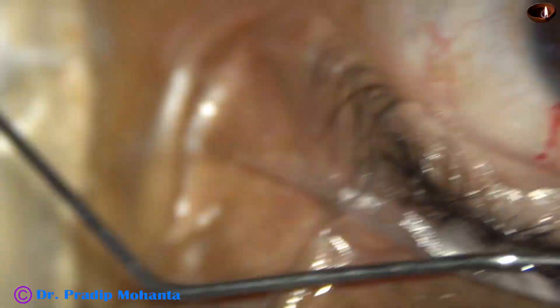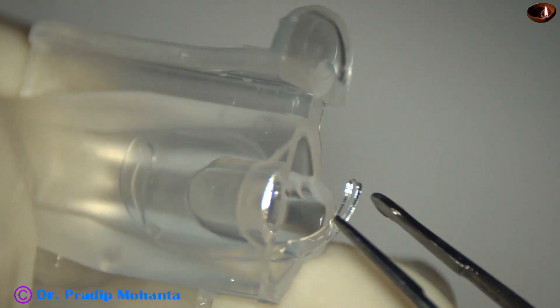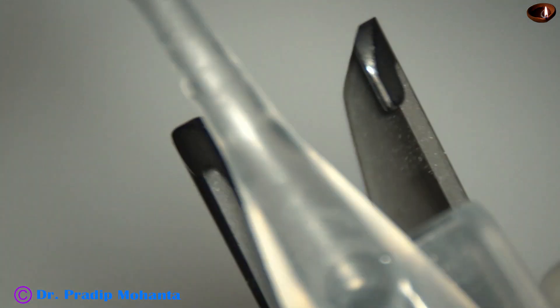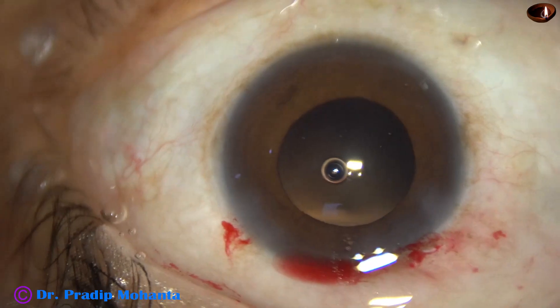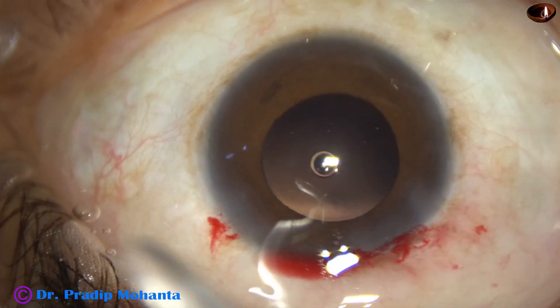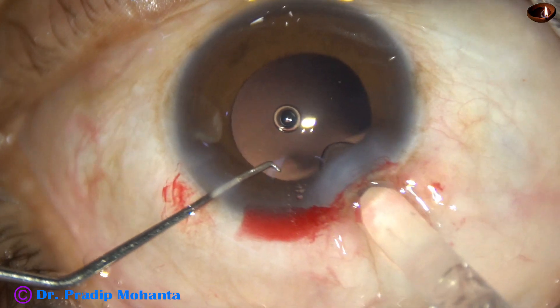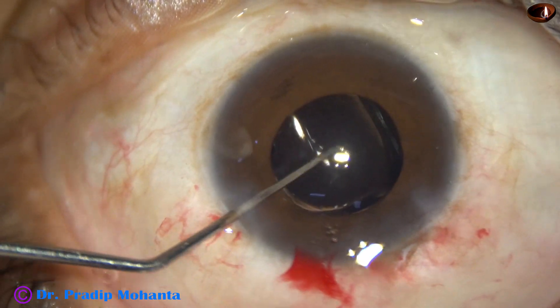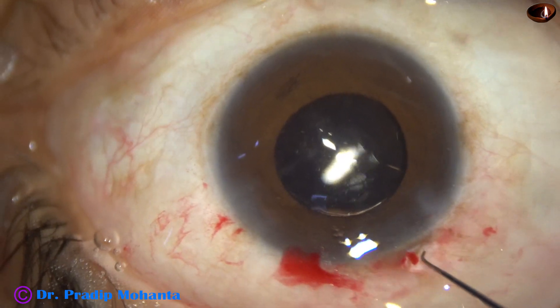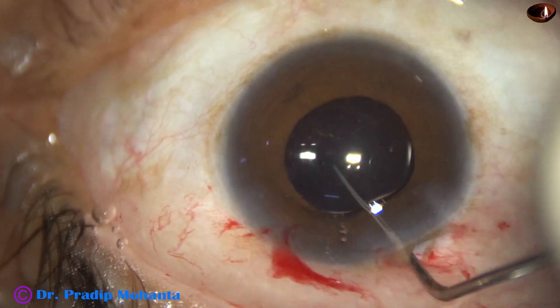The nucleus has been managed, the anterior chamber is filled up with visco, and now this is the lens. It's a very good lens — this is Tecnis 1 from Johnson & Johnson, USA. No glistening; it remains clear over the years. Aspheric optics give a very sharp focus and a crystal clear image of an object on the retina with optical correction. The lens goes into the capsular bag, unfolds, and occupies its position in the capsular bag.